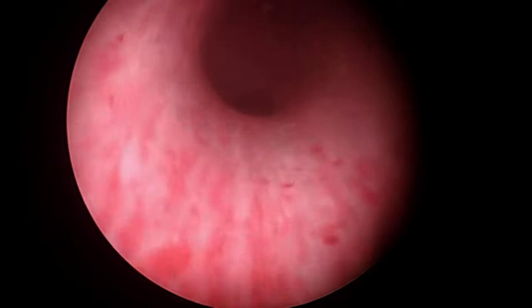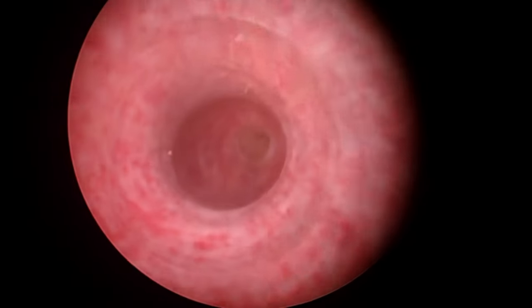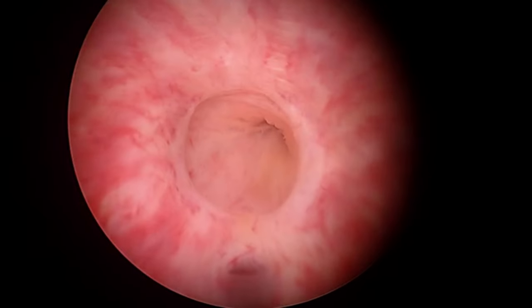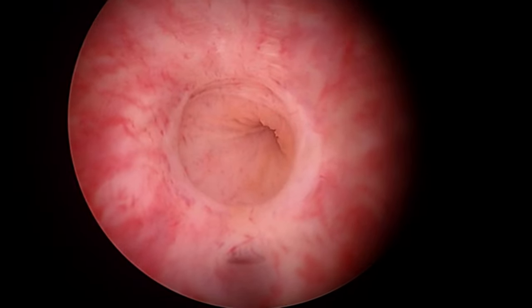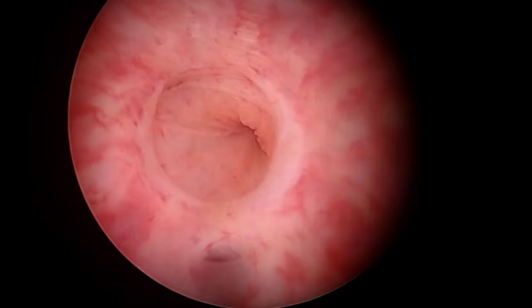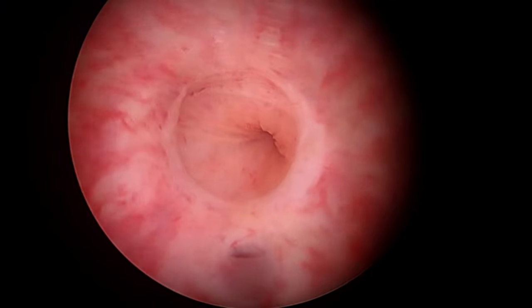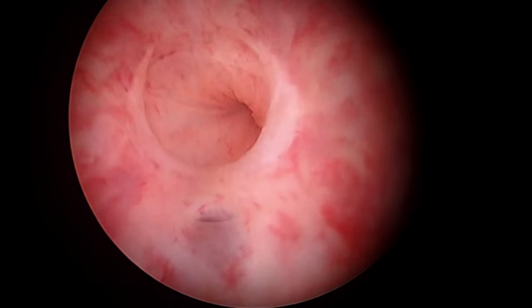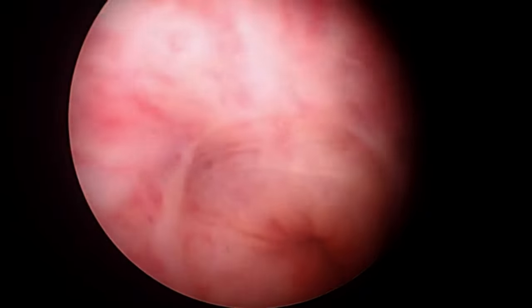This is a case of cystoscopy on a male urethra. As we go through the urethra, we see this area of narrowing in the caliber. This is an area of urethral stricture — a short stricture caused by scar tissue. This happened because of previous injury or infection.